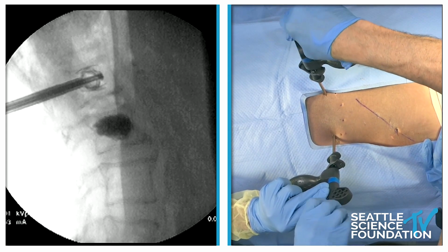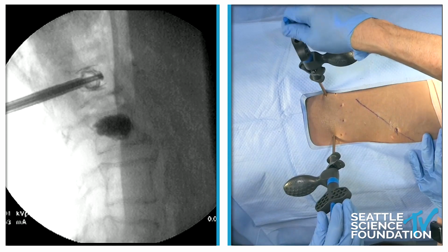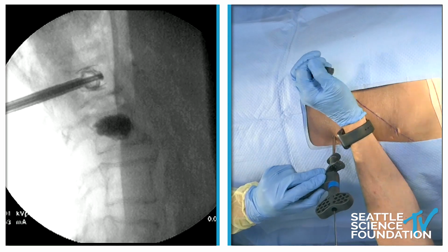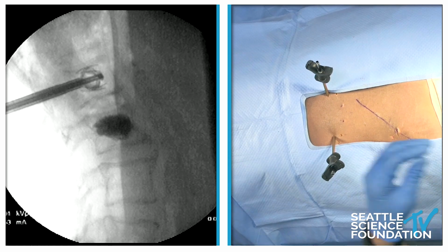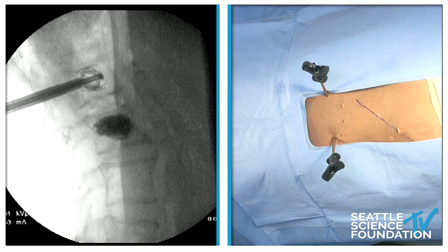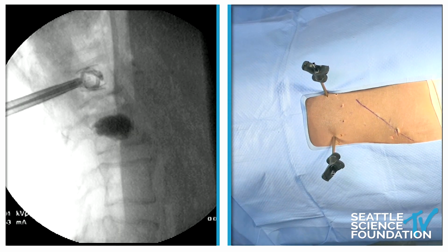And then when we unscrew the colored knob, we'll resist the urge to hold on to this handle because that's not any use for them. So we'll take this and we'll pop it off like this. Good. And once we pop these off, now it's going to be ready for cement installation. All right, so let's see what we have here in the lateral view. Very good. And so this is cement called Striker HV, and this is what we'll do.